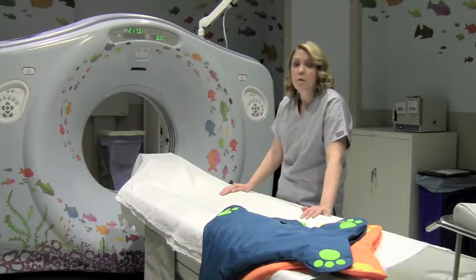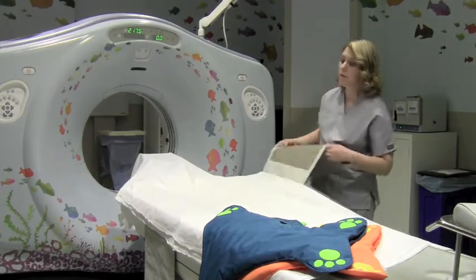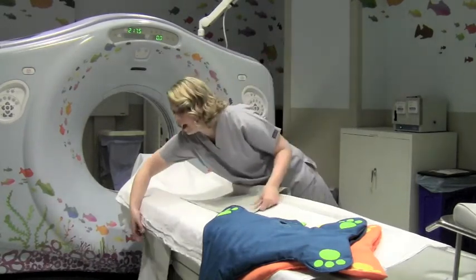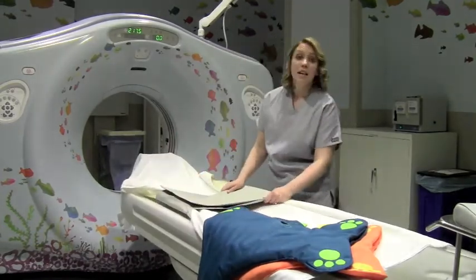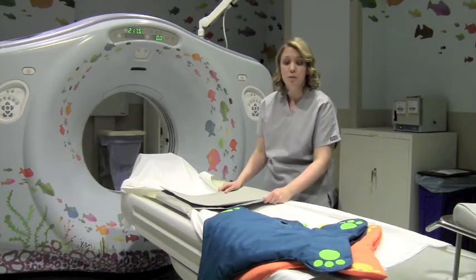Traditionally in radiology, without the Brave Palp, we use straps in order to provide safety for the patient while they're out of bed. They are placed on and secured onto the table so that it will prevent them from falling off during their imaging procedure.